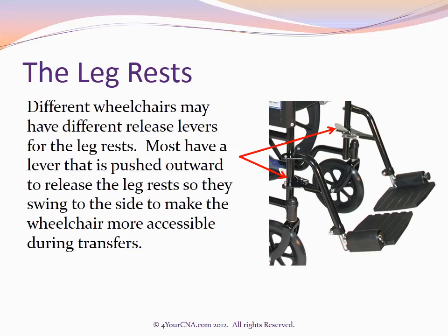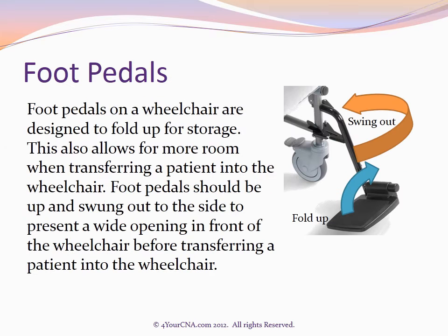Different wheelchairs may have different release levers for the leg rests. Most have a lever that is pushed outward to release the leg rests so they swing to the side to make the wheelchair more accessible during transfers. Foot pedals on a wheelchair are designed to fold up for storage. This also allows for more room when transferring a patient into the wheelchair. Foot pedals should be up and swung out to the side to present a wide opening in front of the wheelchair before transferring a patient into the wheelchair.